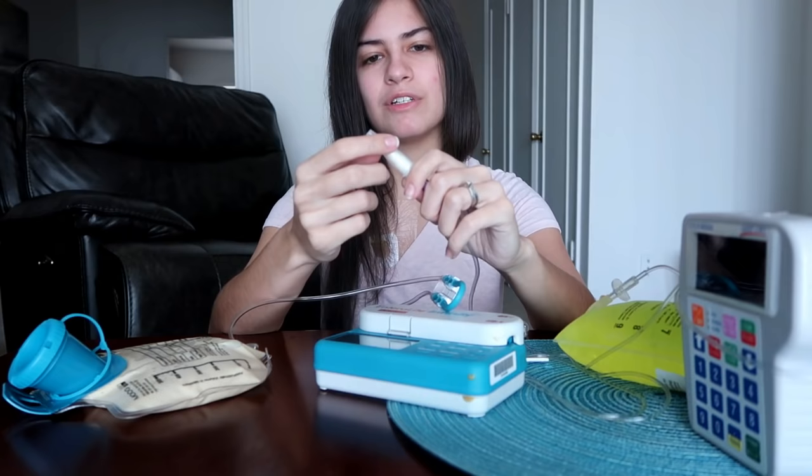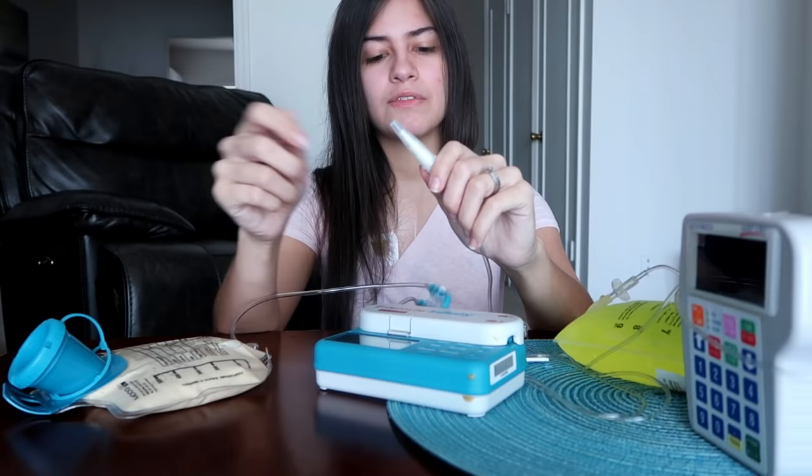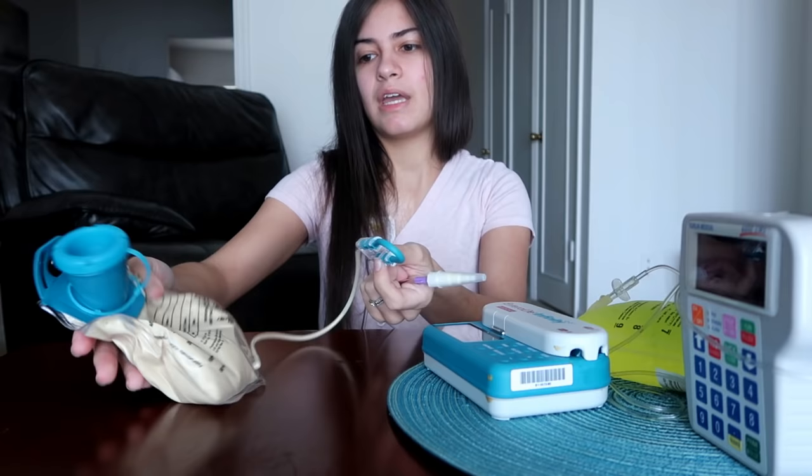And there's two ways to do this. One is you can use the pump and hold down the prime key and it'll do it for you, or you can hand prime. If I'm hand priming, I'll take off this cap, which is kind of fun because it shoots off. Then there's a little teardrop symbol here, and I press that down, and then I squeeze the bag and it goes through. But my hands are hurting me today, so I'm not gonna do it that way. I'm gonna use the pump.